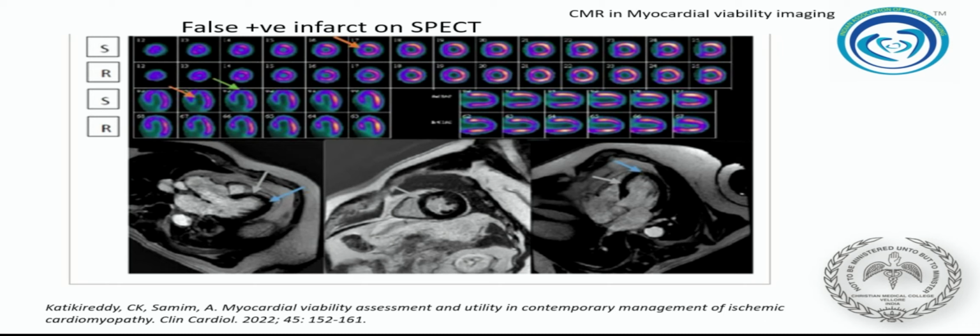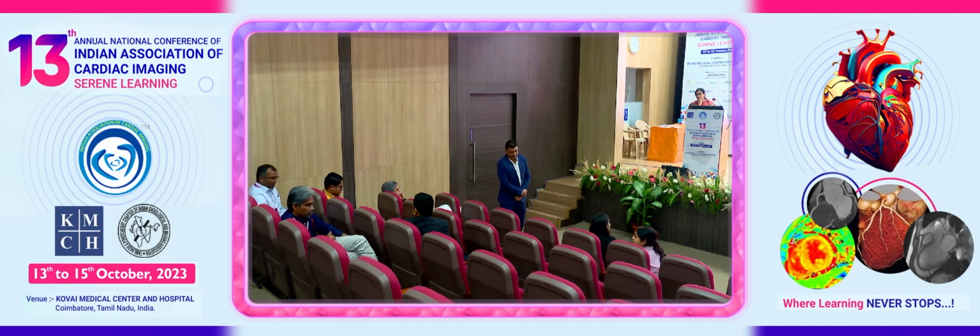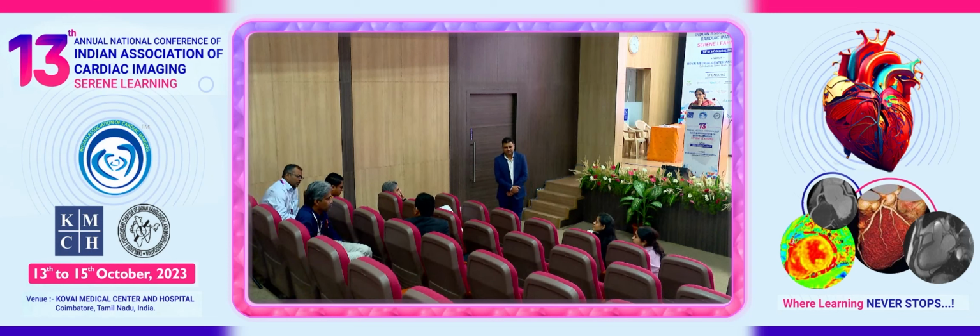One question to you, Kamlesh. Initially, a long time back, we always used to talk about balanced ischemia being a problem. Is that resolved now? Myocardial flow reserve quantification resolves it, but that is not available everywhere. So it is still a big thing, but based on experience, if you see more and more cases, then you can find out balanced ischemia also. It is very difficult, but based on experience you can find out. But myocardial flow reserve, as I told, new cardiac SPECT cameras have myocardial flow reserve assessment. With that we can see.